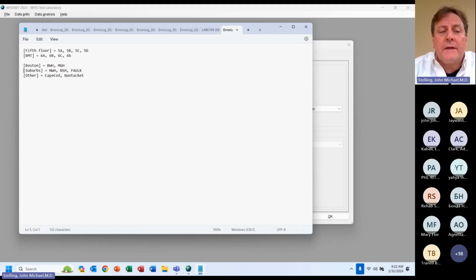So yes, I do have the latitude and longitude of all of these hospitals, but that's very rigid. And as I said, 2 miles in the city of Boston, you already have like 5 hospitals. 2 miles out in Nantucket is on an island. So 2 miles doesn't really mean the same thing. So even if I do have the latitude and longitude, we still find it valuable to group the hospitals in this kind of way, which is more meaningful with regards to patient sharing areas.